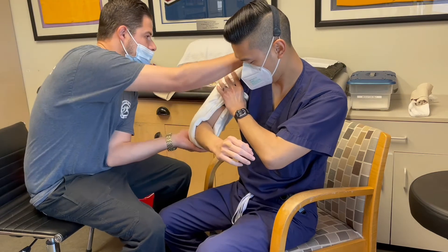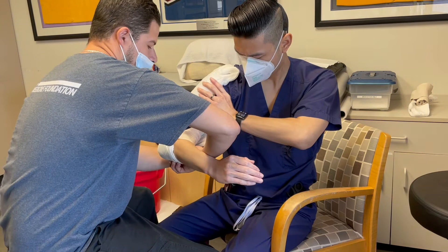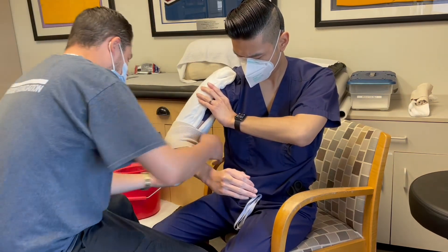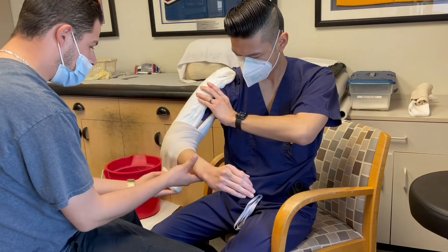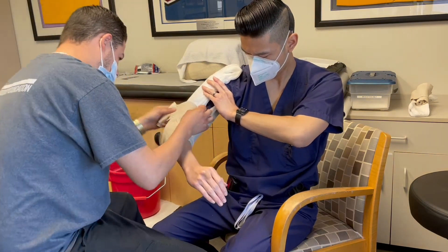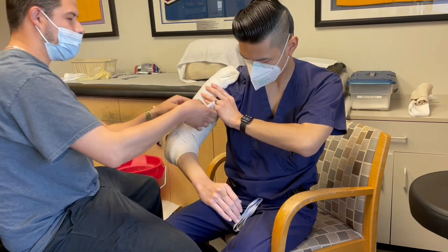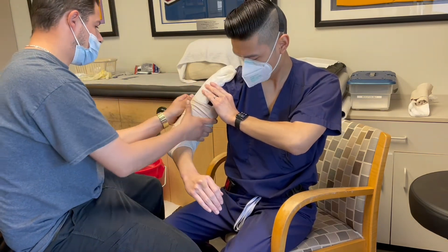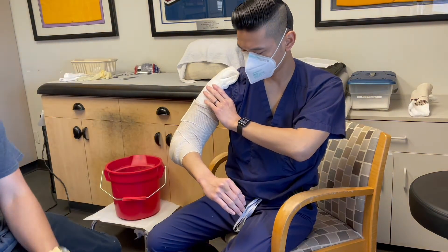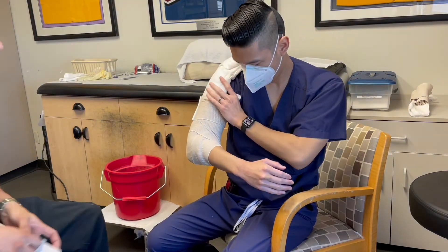Now go ahead and reapply the coaptation splint. Make sure the elbow is at 90 degrees and wrap the elbow as shown.